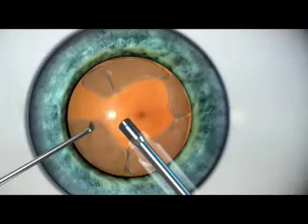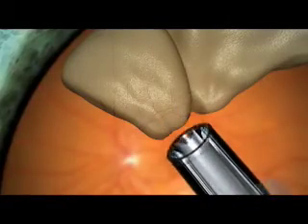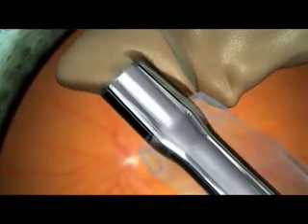With Stellaris, fluid flow attracts the lens material to the phaco needle tip. The longitudinal movement of the phaco needle combined with flow facilitates mechanical cutting of the lens, efficiently breaking it into fragments. Using cavitation, the fragment is then emulsified and aspirated from the eye.